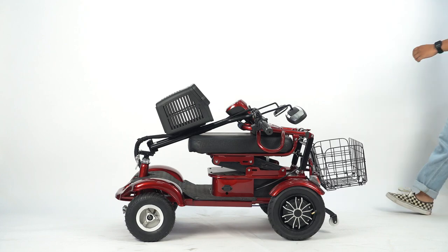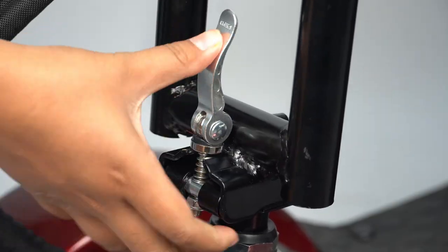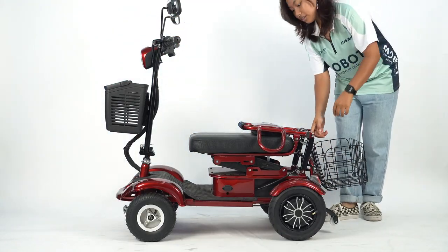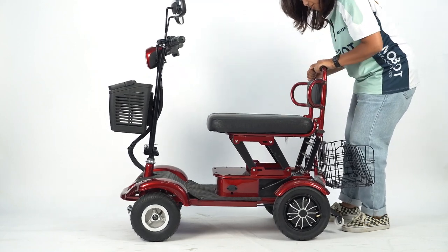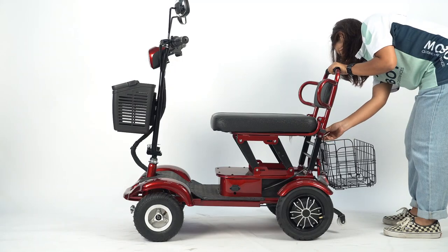Unfolding: Press the metal tip while lifting the handle stand up and lock the screw. Lift the chair up, shift the screw in, and tighten the screw.